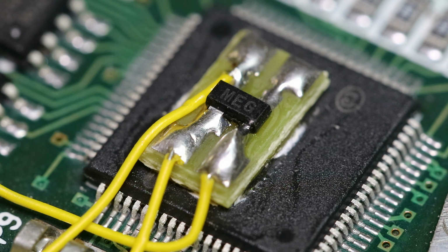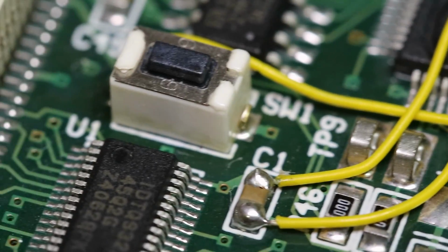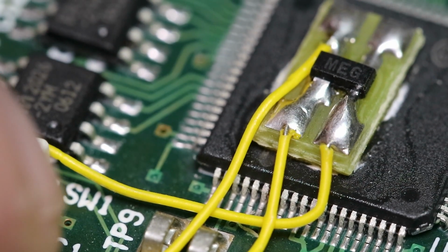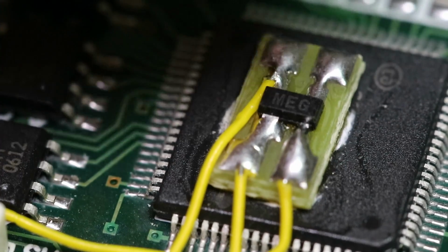I popped on the macro lens so we can get a better look at this bodge job they've done on this chip. Now I've determined that the SMSC chip on the other side is actually a USB 2 4-port hub. So it makes sense that this chip on this side is one as well to provide the 8 ports. This just says MEG, and I don't know what it does or what it is. They seem to be using only 3 terminals on it, and it's wired into a capacitor, so it's probably getting power from that on both sides of the rail, and the other side is going to one side of the switch. So my guess is this is something to do with a reset system. They were probably having problems with it resetting, and this is either stabilizing or triggering a watchdog reboot or something. I'm not positive on it, but that's just my guess looking at it real quick.